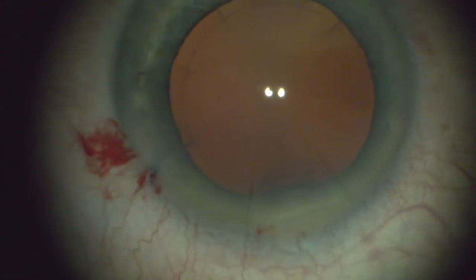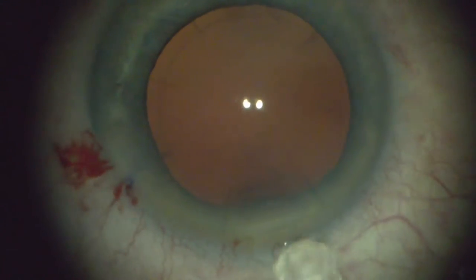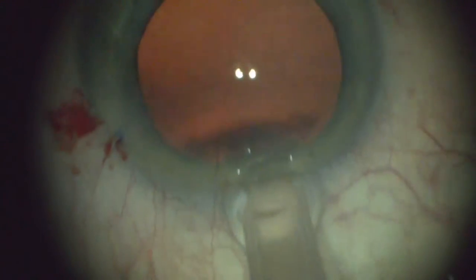This is a post-refractive patient. This patient has had RK, as you can see, on the cornea. The incision is 2.8 millimeters, and this comes out in a planar fashion.